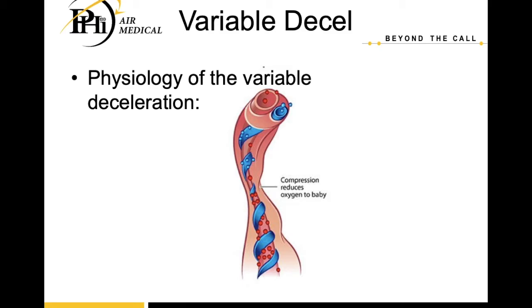So typically when the cord is partially compressed, we get this big decrease in the venous return within the baby. And so you have this baroreceptor-mediated acceleration to try to have an adequate cardiac output. But then when the cord is fully compressed, as the contraction happens, or as the cord is fully compressed due to whatever, all of a sudden they have this big hypertension because they already had that acceleration, and now we pinch off their exit essentially. So now they've got this big hypertension happening.